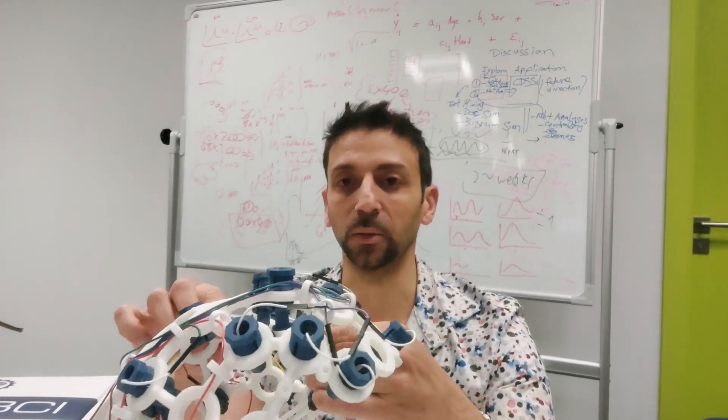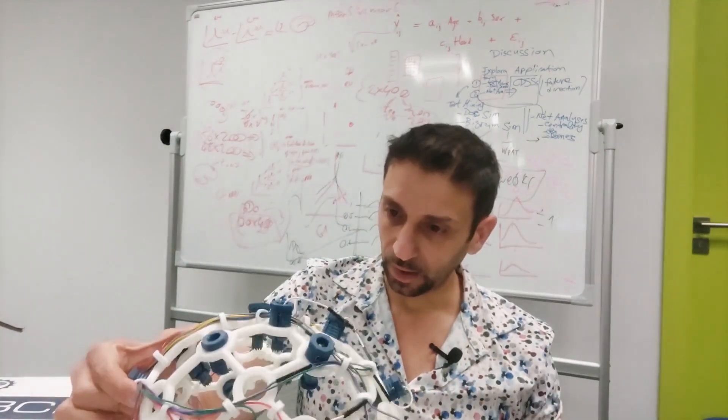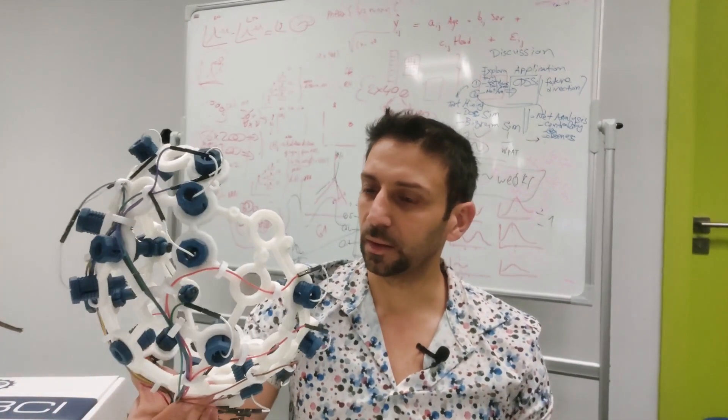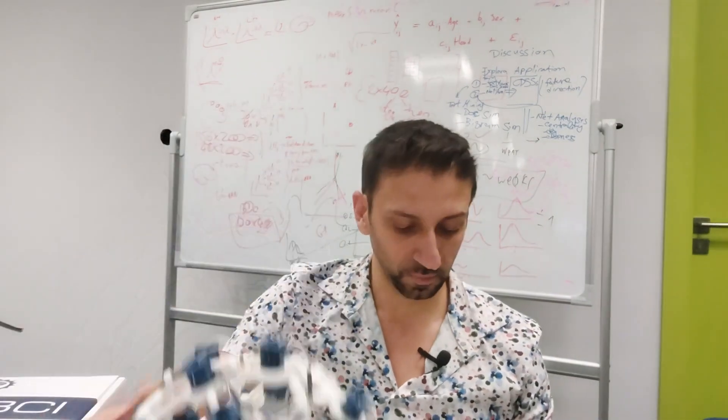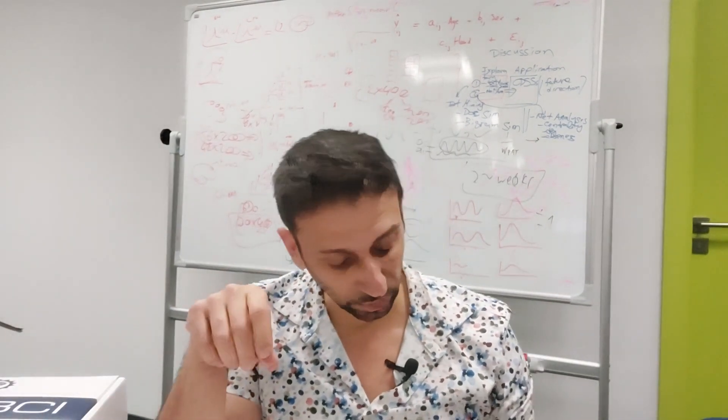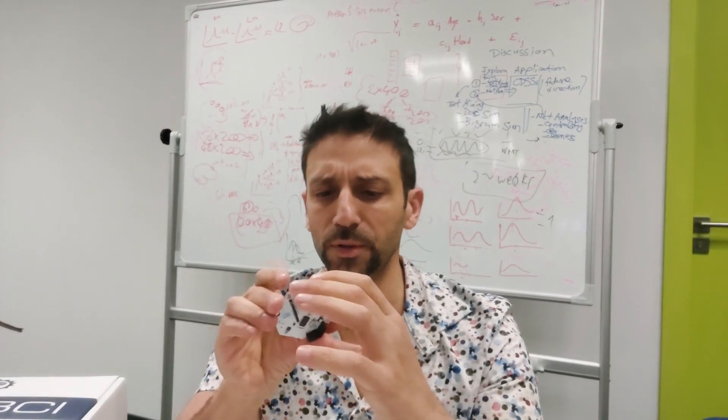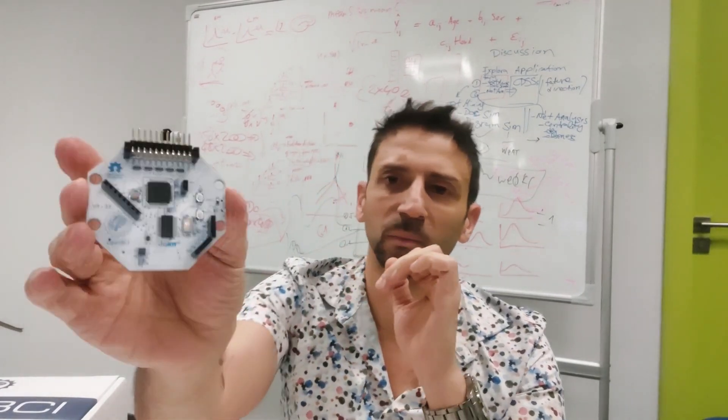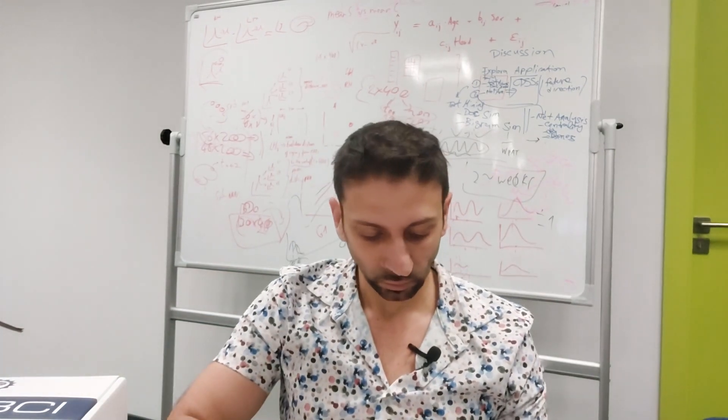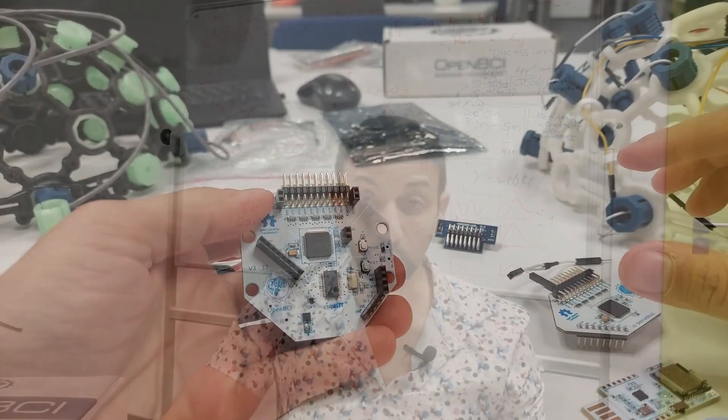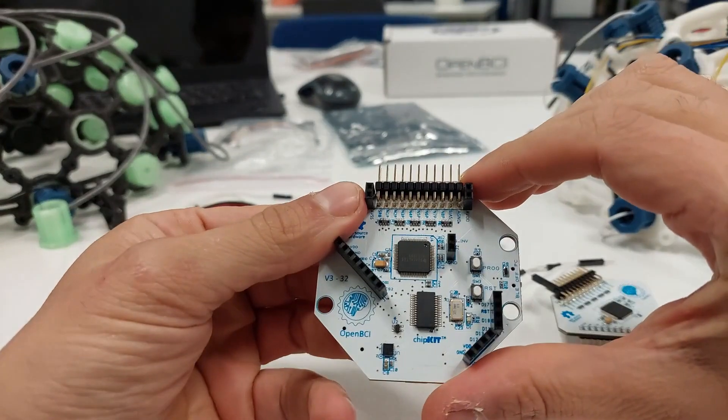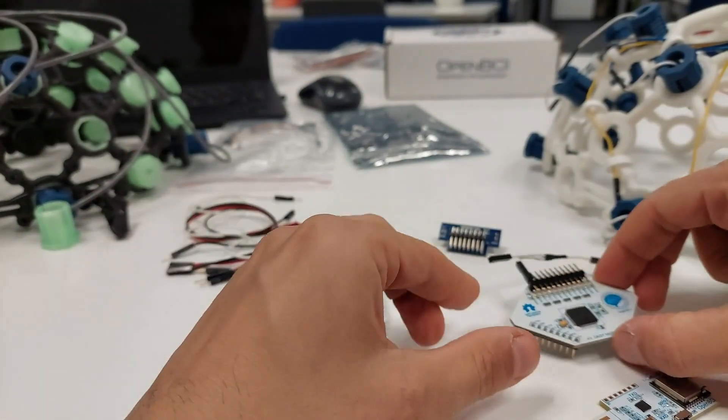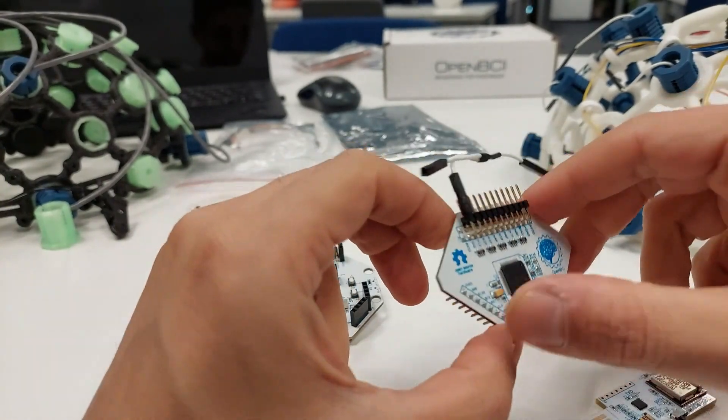There are dry electrodes or wet electrodes for reading the signal you need to read and amplify. There are some boards, for example this is the Cyton, which is only for eight channels and that can be expanded with the daisy mode. So essentially you have to put together the daisy and the Cyton.